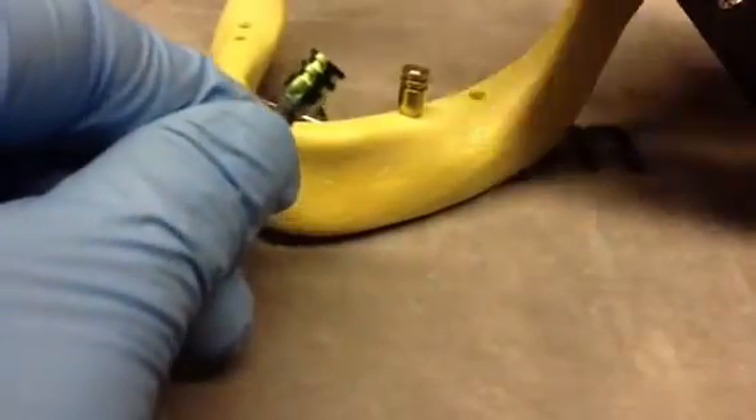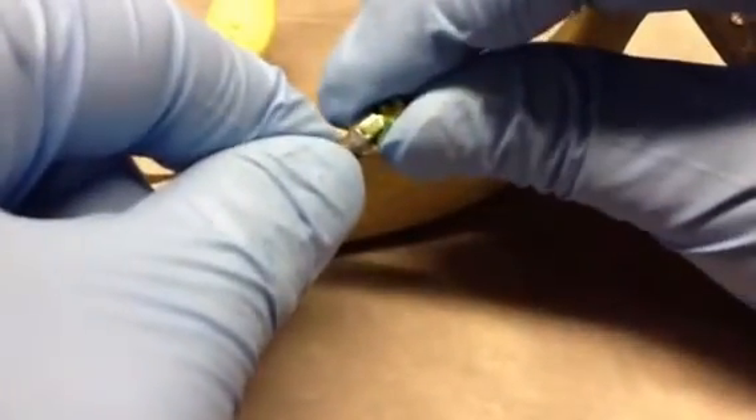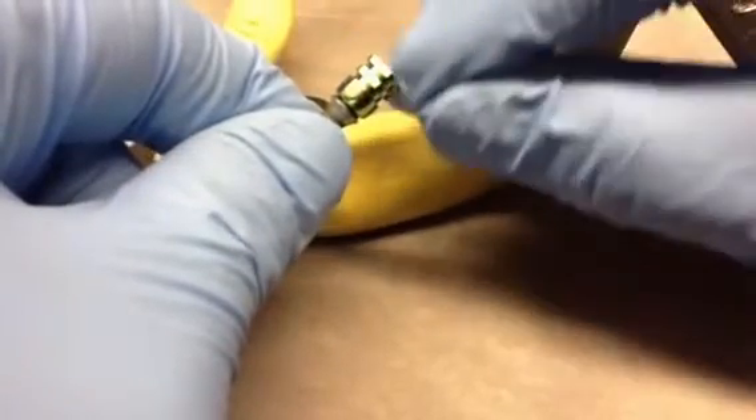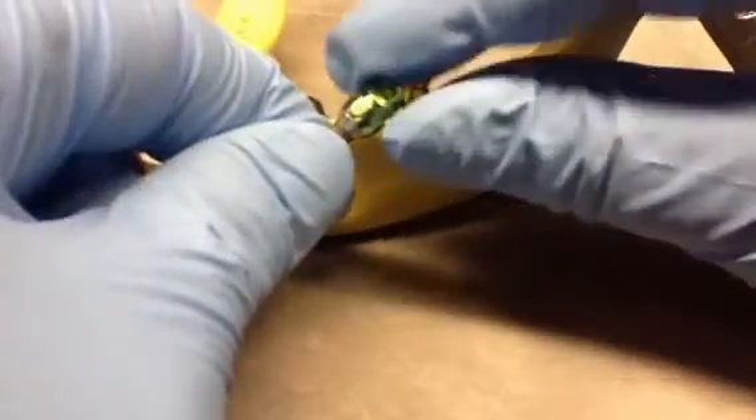The Aton Solid Abutment Transfer Coping is machined from one piece of titanium. The coping snaps onto the solid abutment, eliminating the need to take a plastic component and expand the tissue by 1.5 mm.